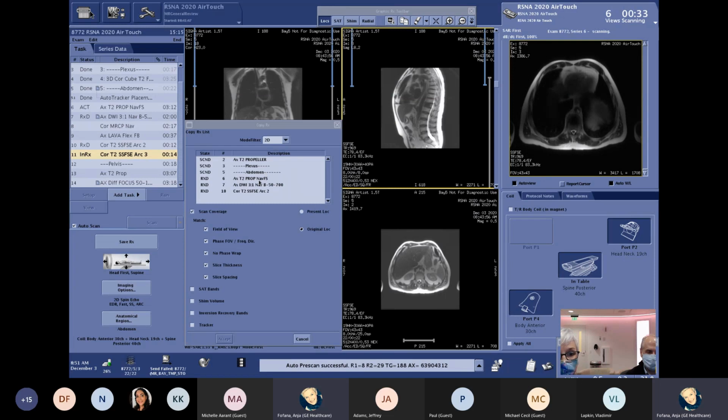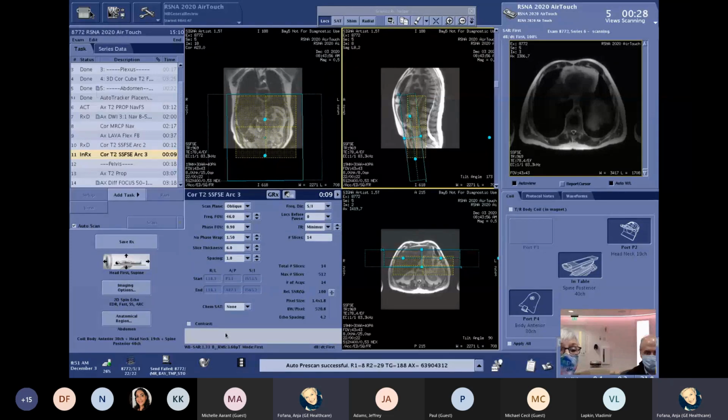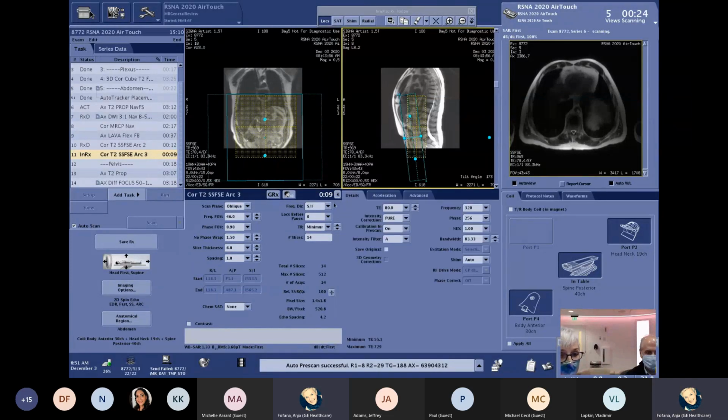And now the other advantage, which we want to talk about and show a little bit, is that since you have so many channels in the field of view, you are now able to accelerate higher. When we had old coil designs with fewer channels, we would allow you to accelerate by a factor of 2. And now with the air coils, we have 30 elements in the front of the patient. The table is 40 elements in total. So we have way higher channel count in the field of view.